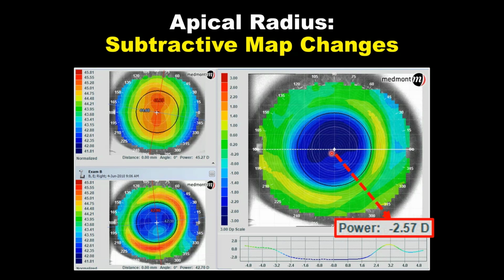How much did the ortho K treatment flatten the cornea out, and therefore how much myopic reduction did we create? So for this patient, a 2.5 diopter myopic reduction, we should have exactly a 2.5 diopter change in refraction. And in fact, after a night of wear, I think the topography is a little more accurate than the refraction. The patients tend to eat up a lot of minus in the initial days of orthokeratology. Their eye hasn't completely smoothed out. The epithelium hasn't generally responded in a uniform manner. It takes 7 to 10 days for the eye to achieve full effect.